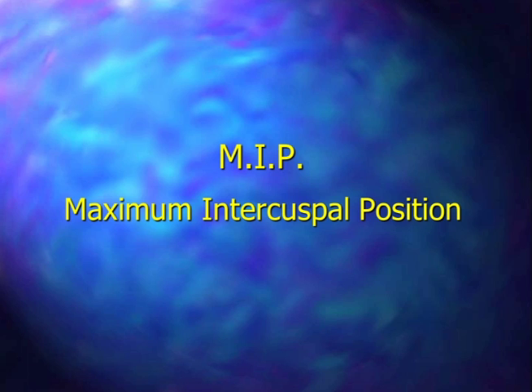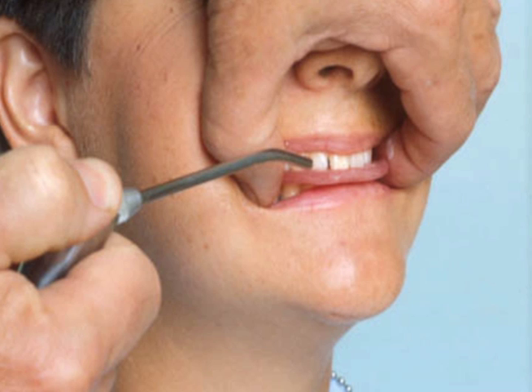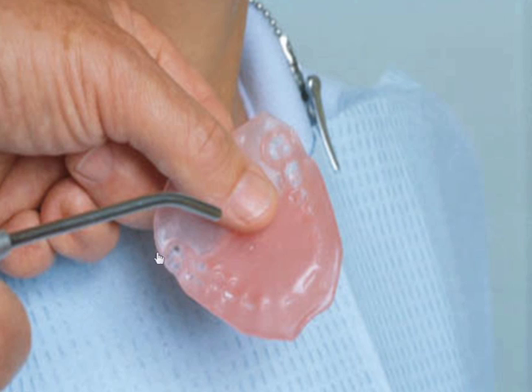Interocclusal records, you have two choices. Most dentists use M.I.P, which is maximum intercuspal position. This is where the patient bites their teeth together. And we do this with a soft pink wax that we heat up in the hot water and then have the patient bite all the way through until their teeth touch, and then we chill it with an air syringe. So we can see where the patient bit through, creating an M.I.P or maximum intercuspal position record.